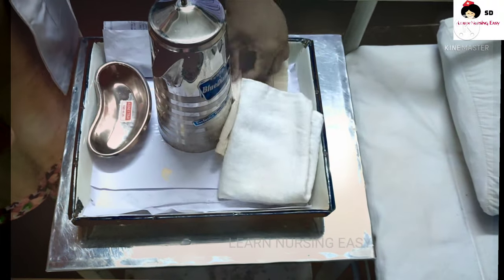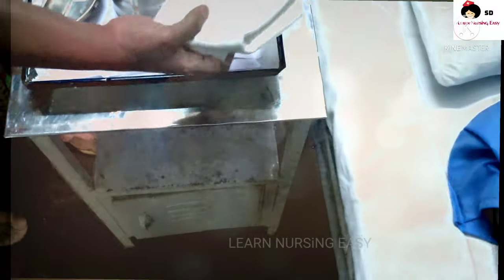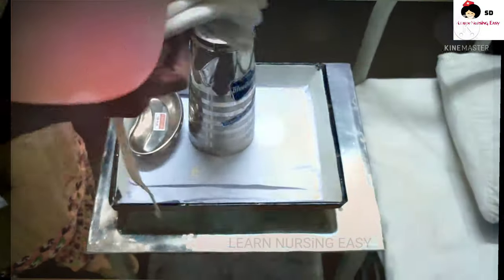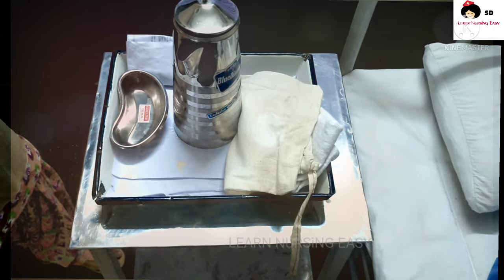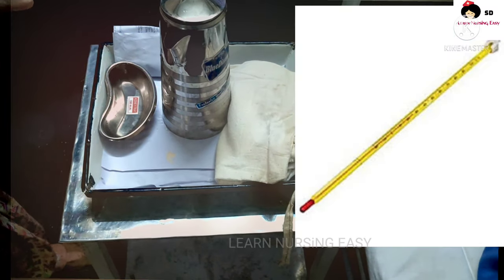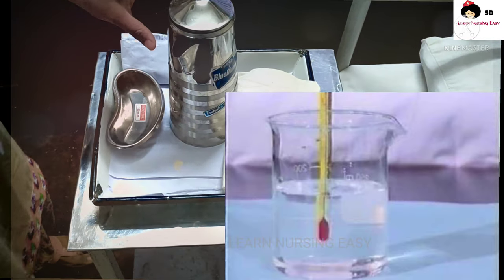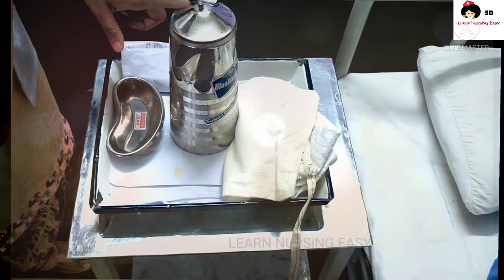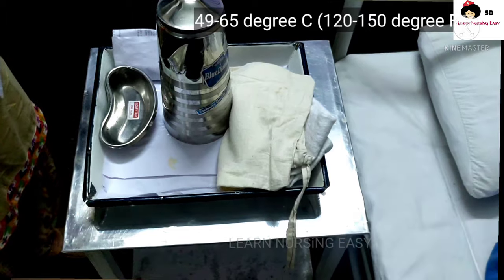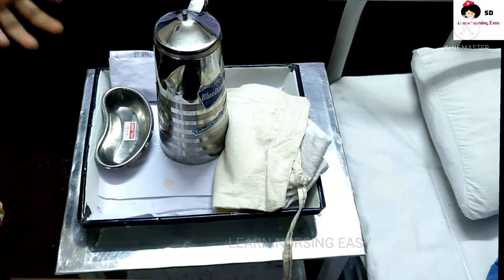To cover the hot water bag, you need a towel or cloth. A dust cloth is needed to wipe the hot water bag if any water spills out. You also need a kidney tray to collect waste, a jug or mug with hot water, and if available, a lotion thermometer to check the temperature. The temperature for hot water bag application is 49 to 65 degrees Celsius, or 120 to 150 degrees Fahrenheit.